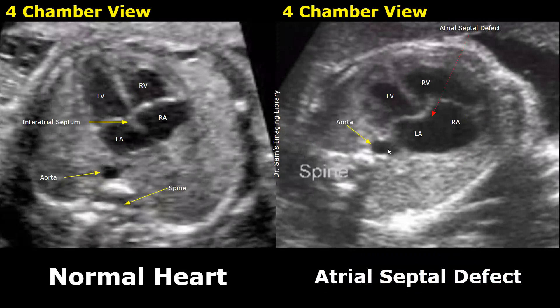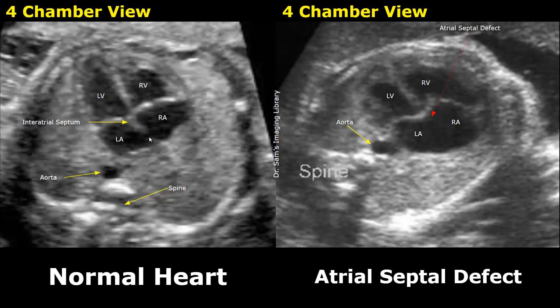Cardiac defects are also seen in a fetus with Edwards syndrome. The image on the left shows a normal heart with right and left atria, and a small wall between them — the interatrial septum. There is a small hole called the foramen ovale, which is normal in a fetus and is not an atrial septal defect. The image on the right shows an atrial septal defect where the interatrial septum is absent.